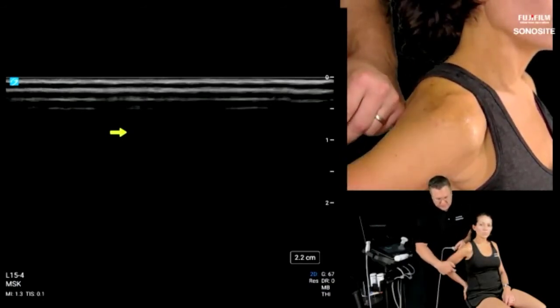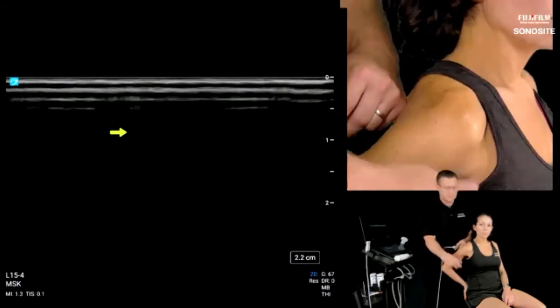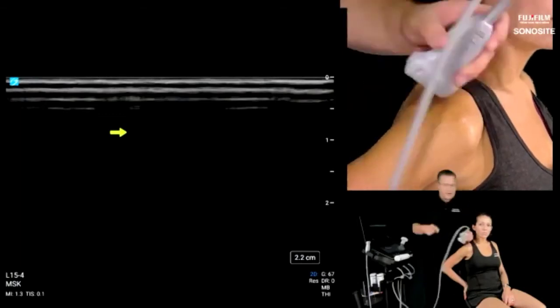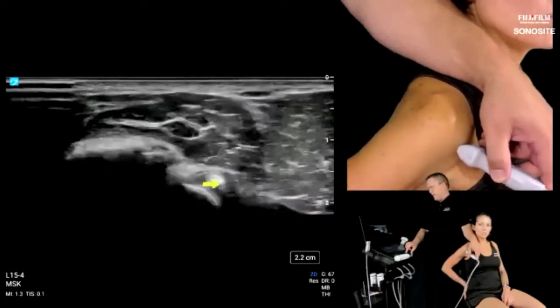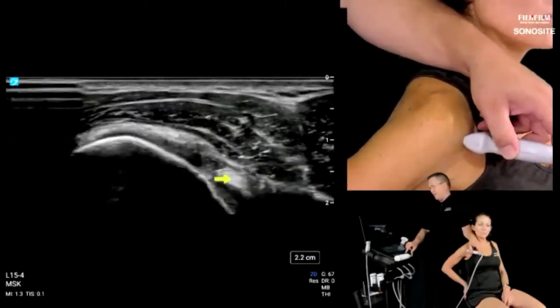The groove is going to be in line with the forearm. So her forearm is pointed to her chest. Mm-hmm. That means the biceps tendon is this far medial. And I'm going to cut it in half, and we're going to look for the biceps tendon in its groove. And there it is, down here, exiting the biceps groove and coming up into the rotator cuff interval here.